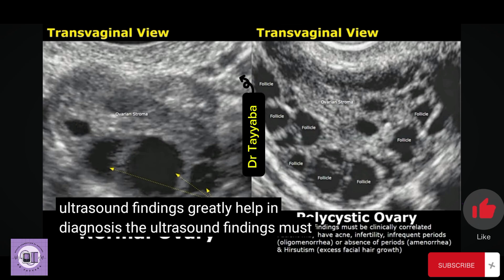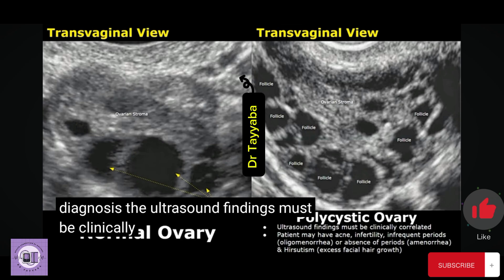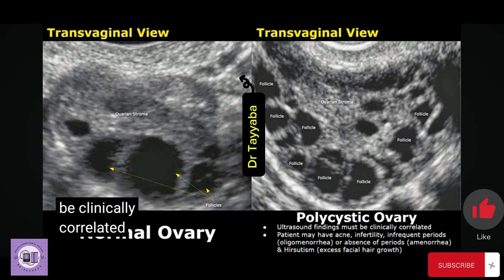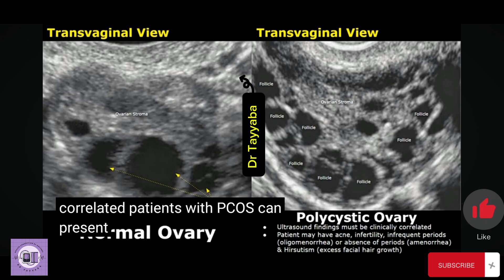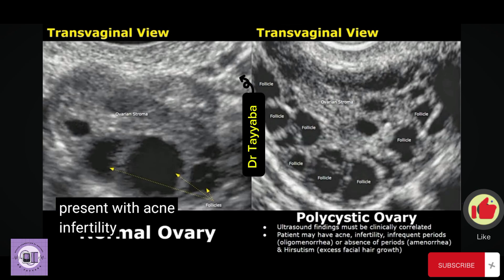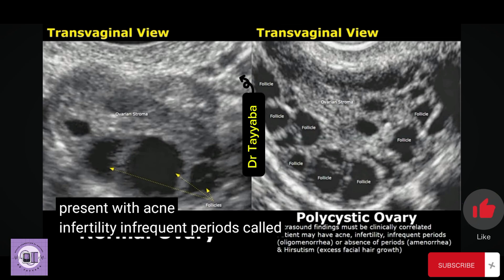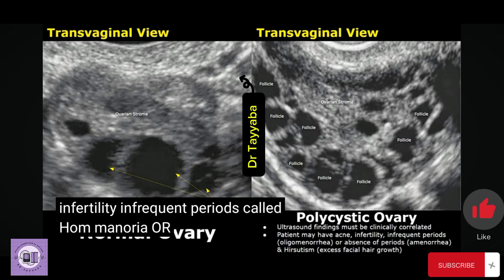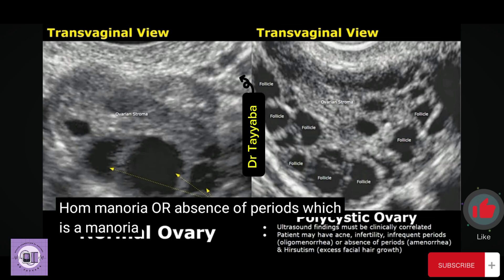The ultrasound findings must be clinically correlated. Patients with PCOS can present with acne, infertility, infrequent periods, or absence of periods, which is called amenorrhea.